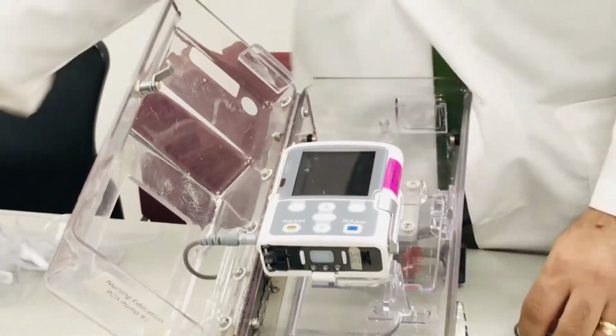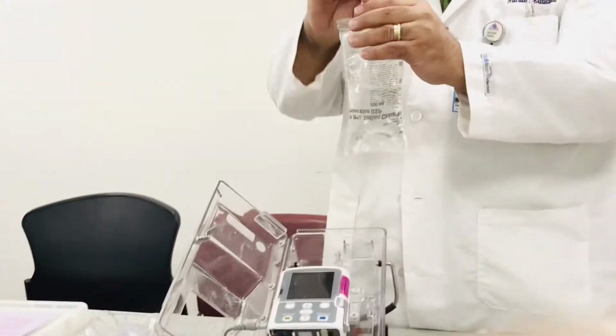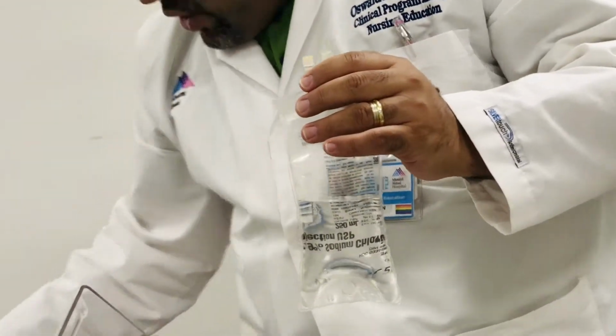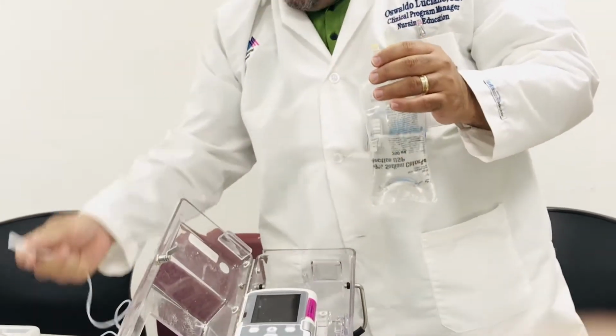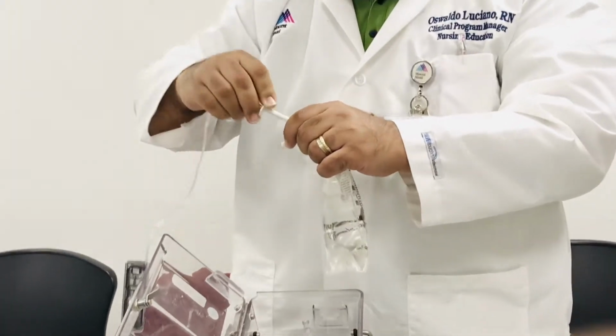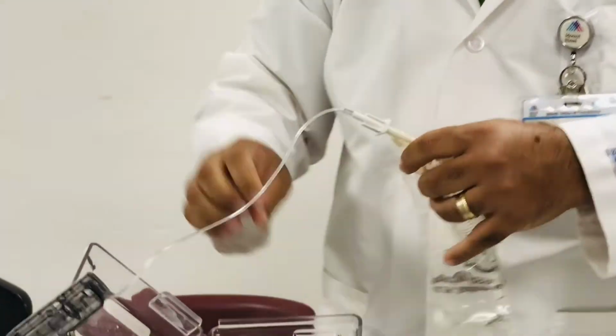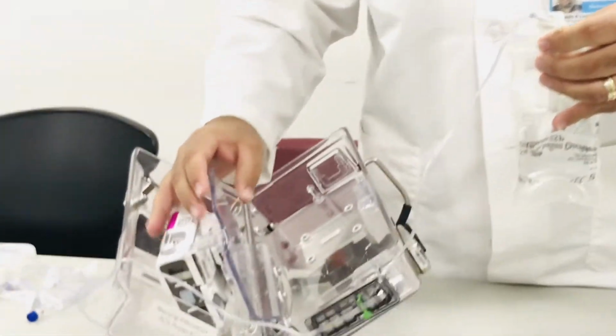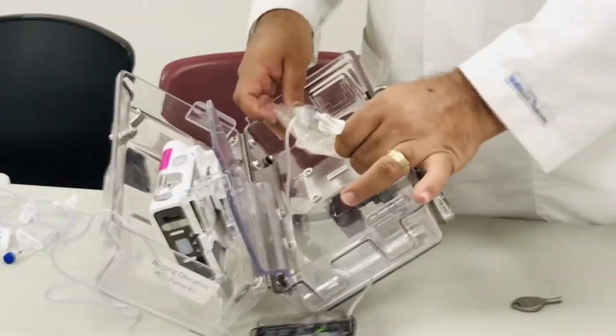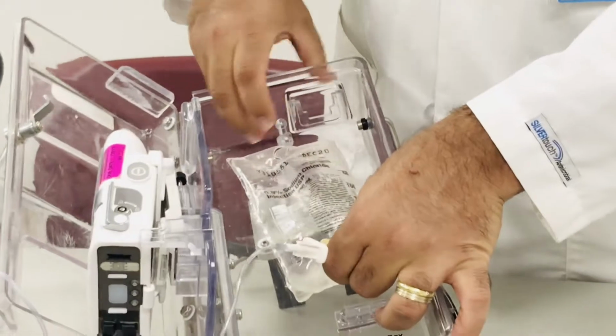Next thing that's important for you to do is to get the medication that you're going to give the patient, and you want to spike the bag. So we're going to go ahead and spike the bag. Okay, you're going to move the machine within the lockbox, and you're going to hang your pain medication.